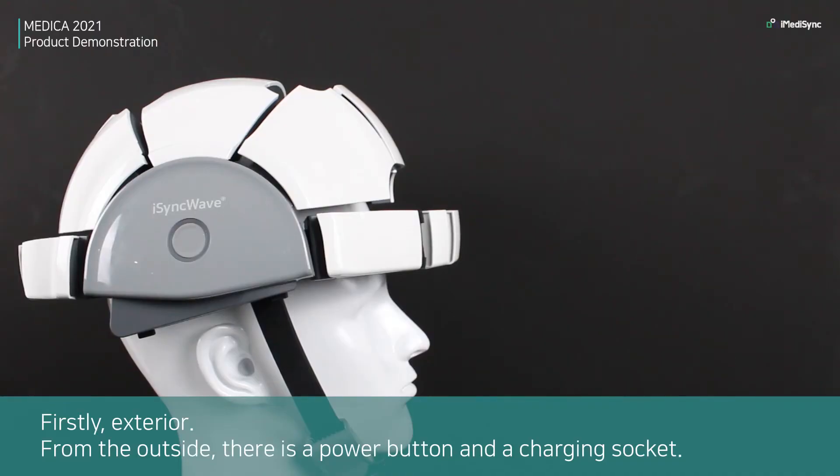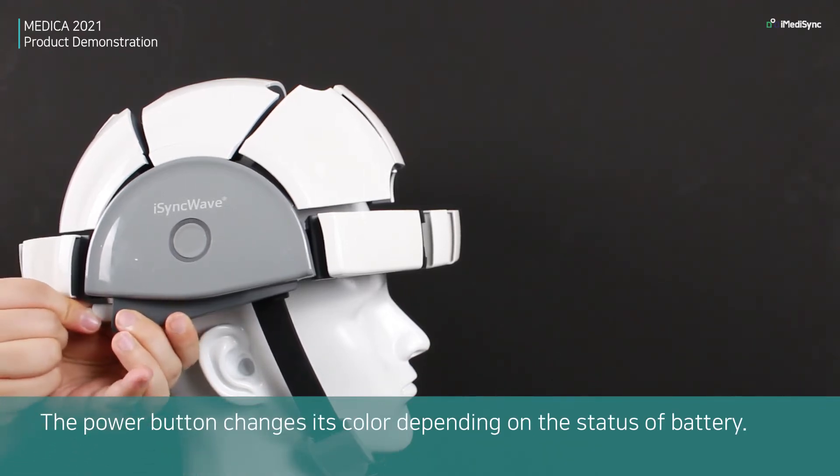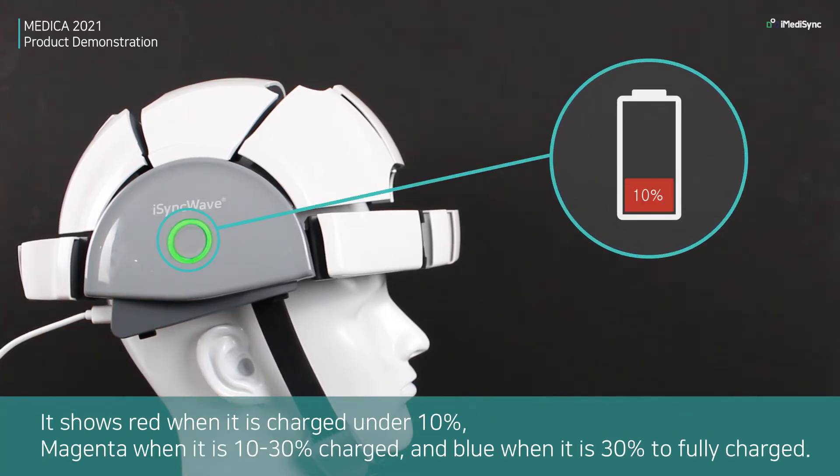Firstly, the exterior. From the outside, there is a power button and a charge socket. The power button changes its color depending on the battery status: it shows red when charged under 10%, orange when it is 10 to 30% charged, and blue when it is 30% to fully charged.